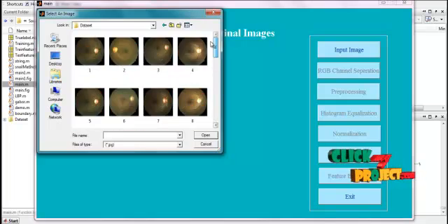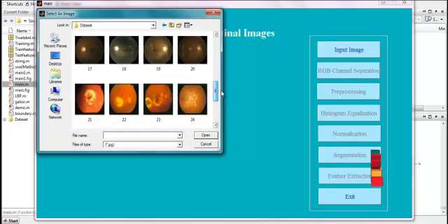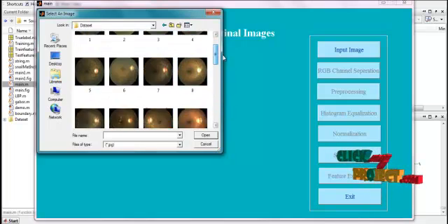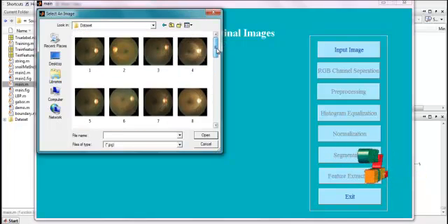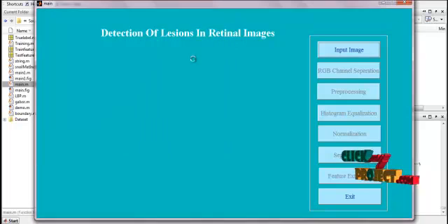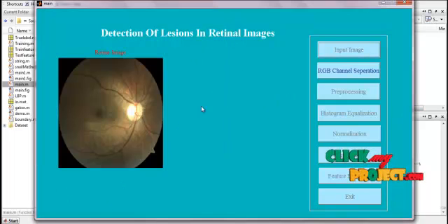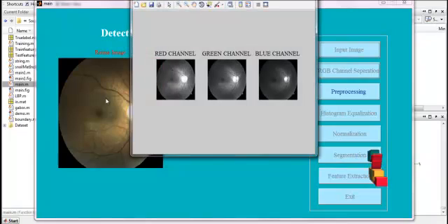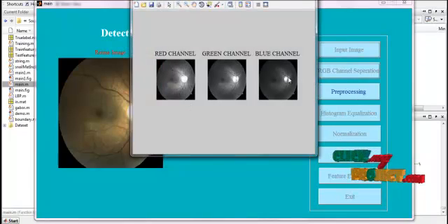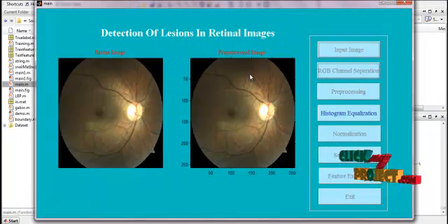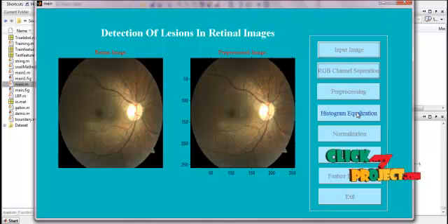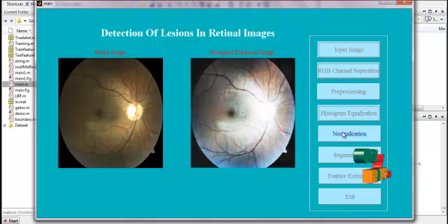We are going to identify micro-aneurysms, hemorrhages, and exudates in the retinal images. You can give any one of the images present in the dataset. The image is selected, and then the three color channels are separated. Then pre-processing is applied using the Gabor filter, and the result is shown. Then histogram equalization is applied.